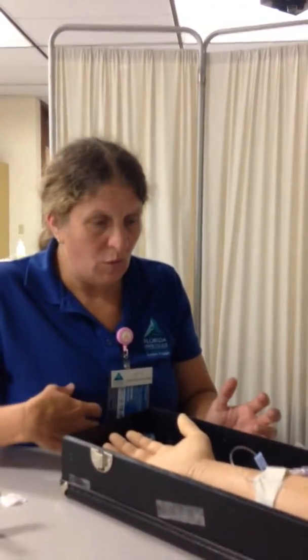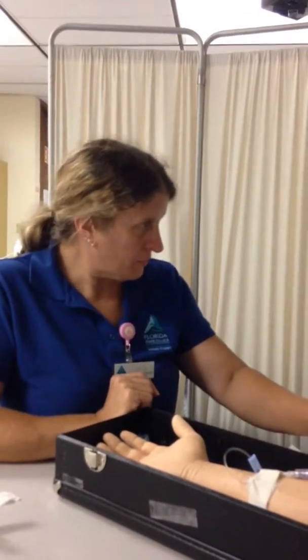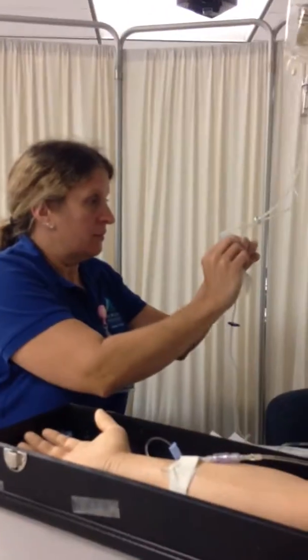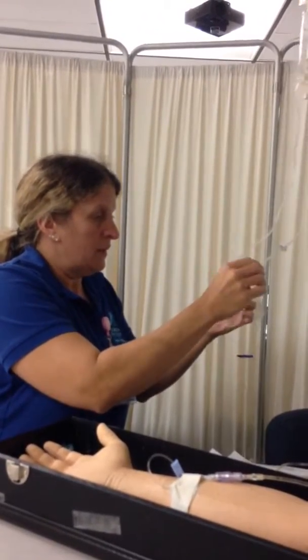Okay, it's been 45 minutes. I'm returning into the room. Of course, I'm going to wash my hands. It's at 20 drops a minute. I'm going to come in and this is empty. So I'm going to disconnect. The tubing itself is within time.